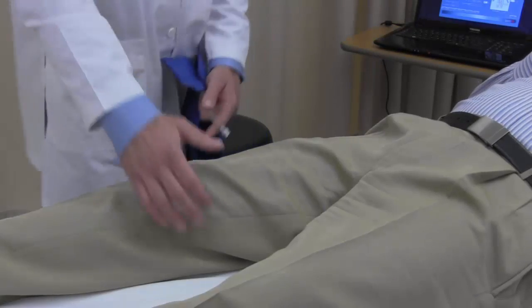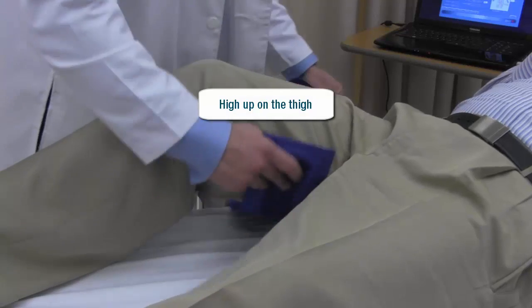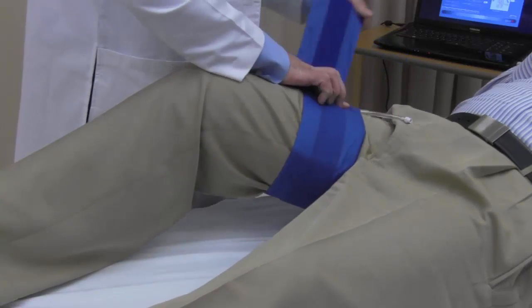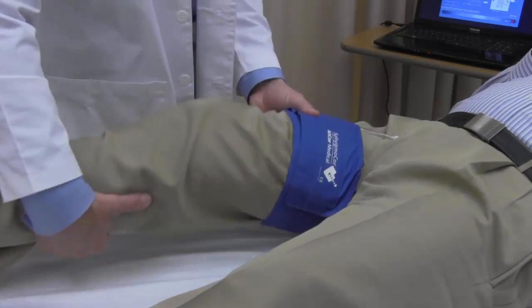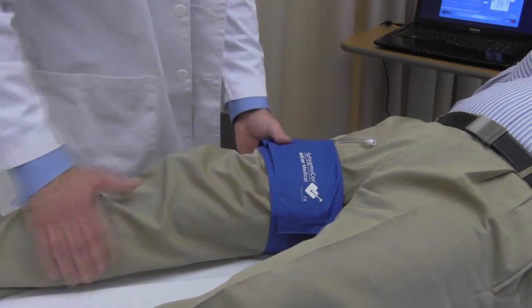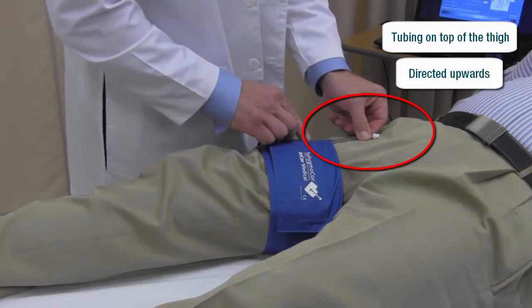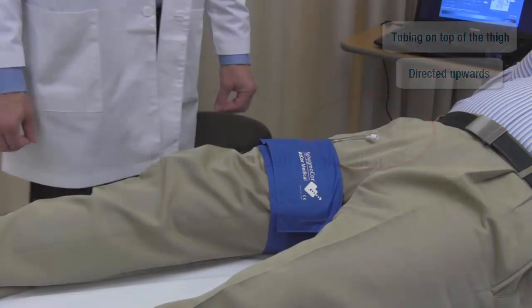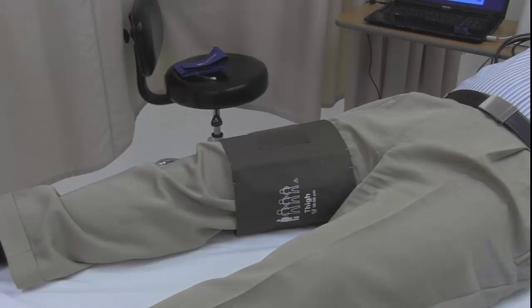Place the thigh cuff on the patient's leg as far up on the thigh as possible. The cuff can be placed over thin clothing, but in some instances it may be necessary for the cuff to be in direct contact with the patient's skin. Ensure that the tubing is on the top of the leg and directed upwards towards the patient's core. Proper cuff application is important for ensuring high-quality data capture.